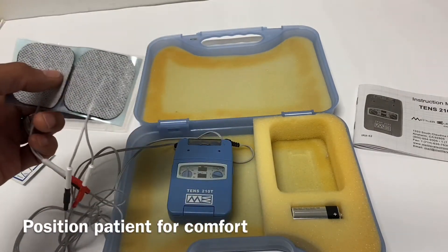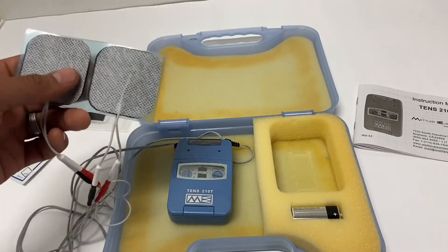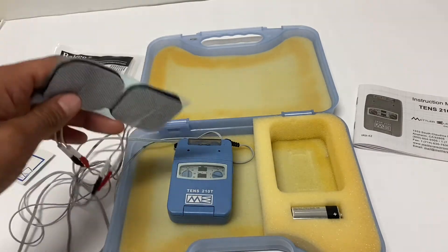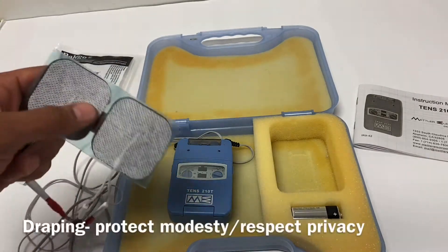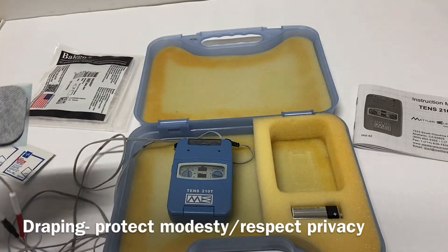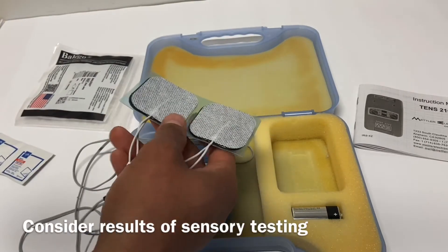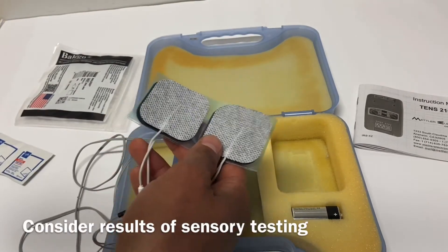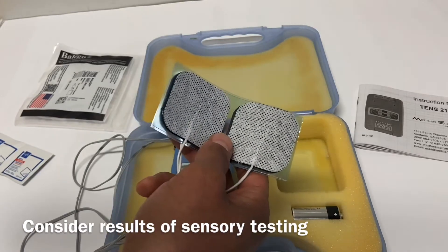Is it going to go on their lumbar spine — are they going to be prone or supine? Is it going to be on their elbow — can they do it in sitting? And then draping as may be necessary if we need to expose an intimate body part. Sensory testing — sharp/dull — this most likely would have been done in your examination before getting into an intervention.